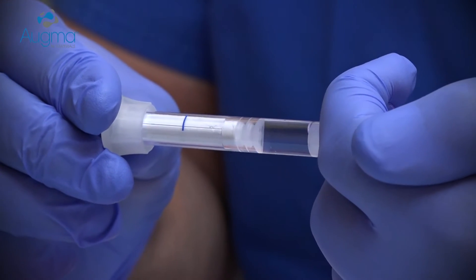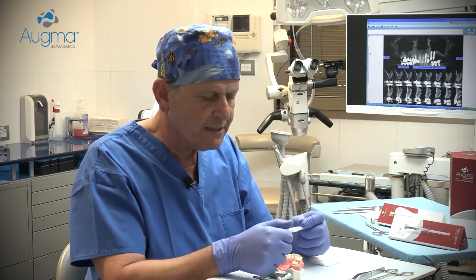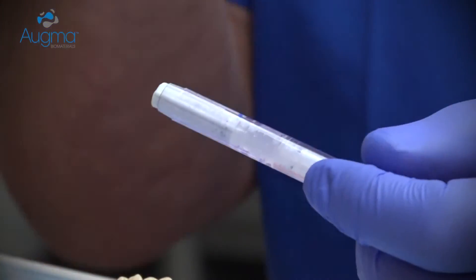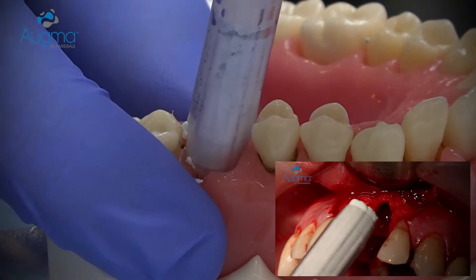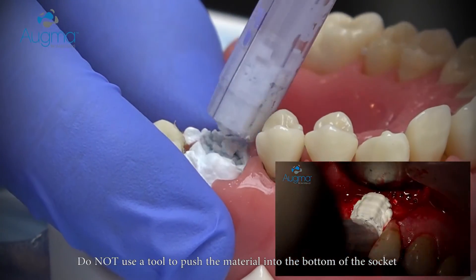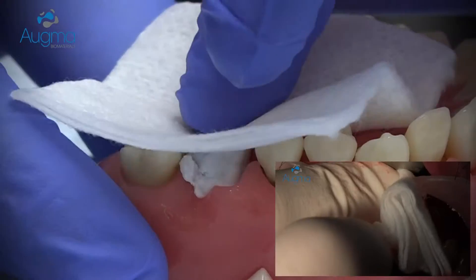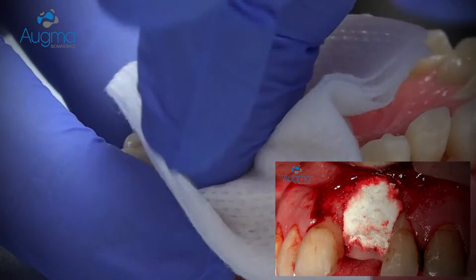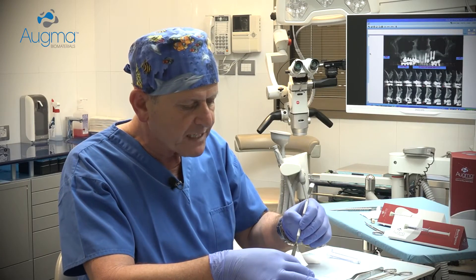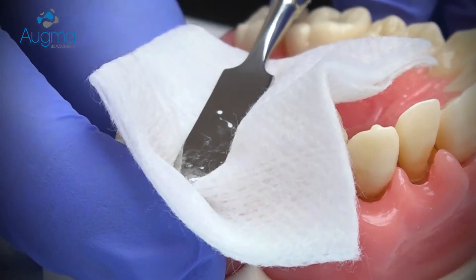Now I would like to demonstrate how to work with Bond Appetite for socket preservation technique when you don't reflect the flap. Press the shaft against the palm of your hand until the first piston reaches the blue line — the material is now activated. Remove the syringe head. Approach to the socket side and eject the material into the socket. Slightly overfill it, then take a dry gauze and press the material firmly into the socket. If there is not enough space for your finger between the teeth, use a spatula or an elevator and press above the dry gauze.